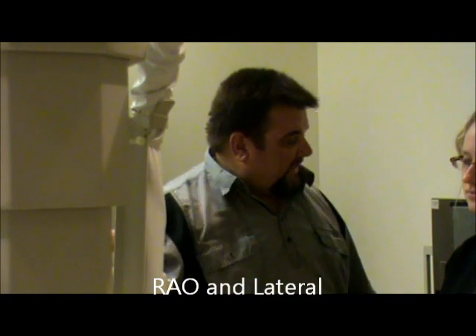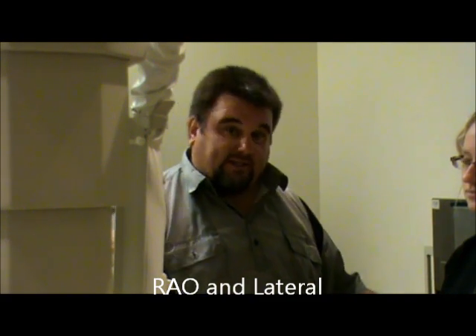Today we're going to be demonstrating a sternum x-ray. The routine views are going to be an RAO and a lateral. Our film size is going to be 11 by 14 lengthwise.